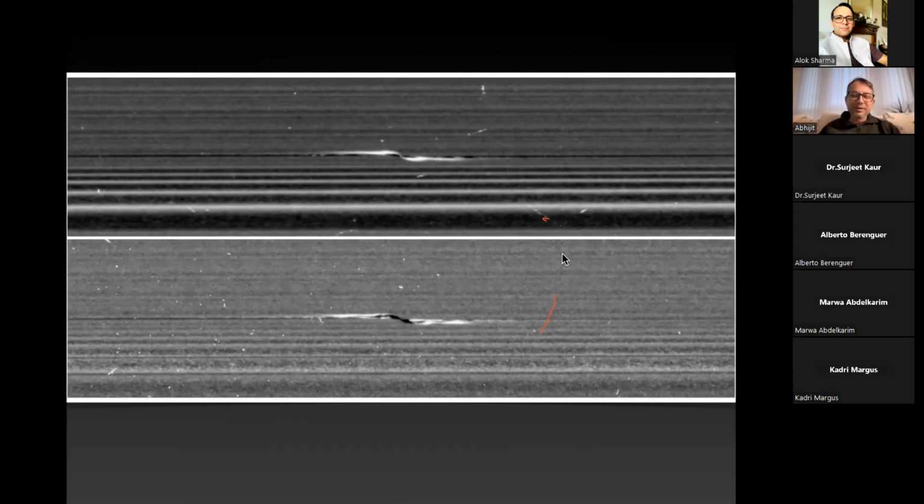So this is what happens when you condition our brain to look into something, and it's a good thing. When we're learning lung ultrasound, we try to identify the pattern. So that's where you guys are getting on. And you are rightly talking about a reflection, or M mode interrogation and all that. That's a very good sign of progress you guys are having.